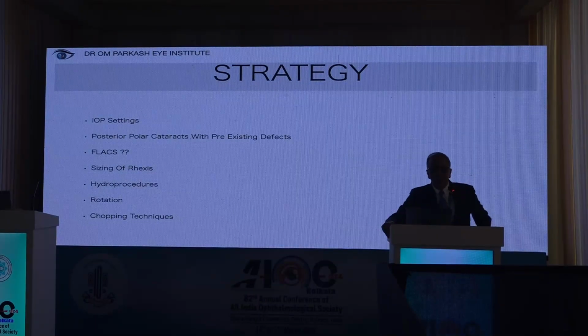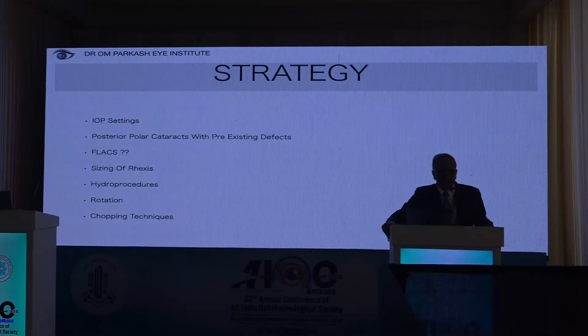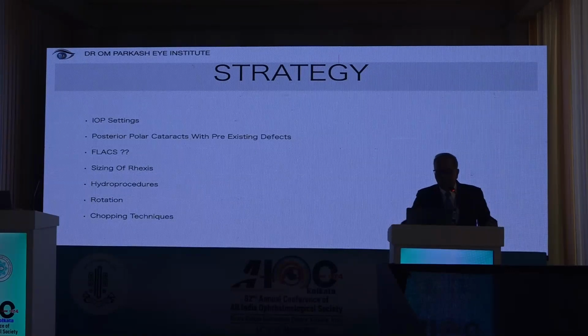Consider the patient as a posterior polar cataract with pre-existing defects. Use FLACS if possible. Sizing of rhexis, as Dr. Saurabh has said, should never be more than 4.8. Hydro procedures should be avoided. Rotation should be avoided, and chopping techniques have to be customized.